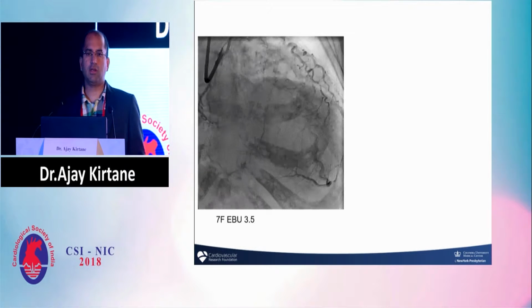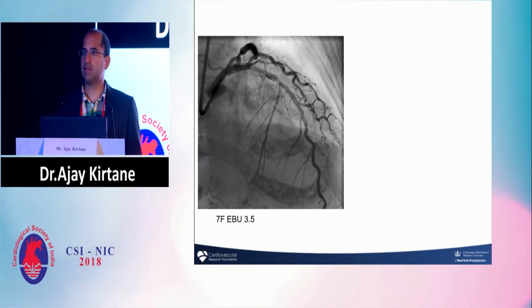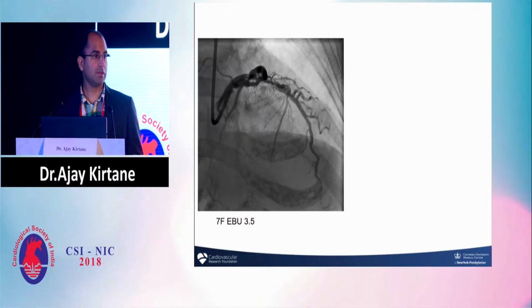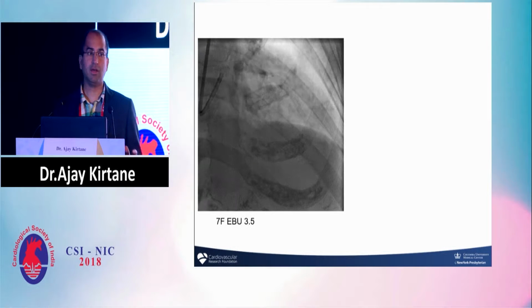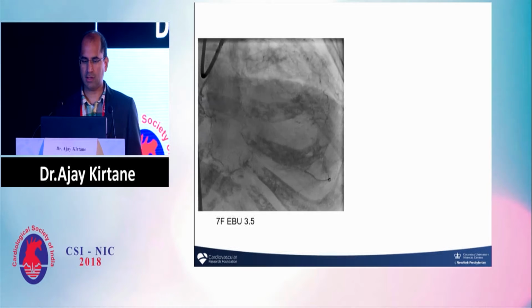And I think you can appreciate in her proximal LAD, that area is stented. It's not fully stented because the stents have been ablated somewhat. There's severe and dramatic underexpansion of the stents. Ziad mentioned that it's hard to tell in many cases whether it's underexpansion or neointima. This is one where you can tell that it's underexpansion because you can see the vessel constrained itself.